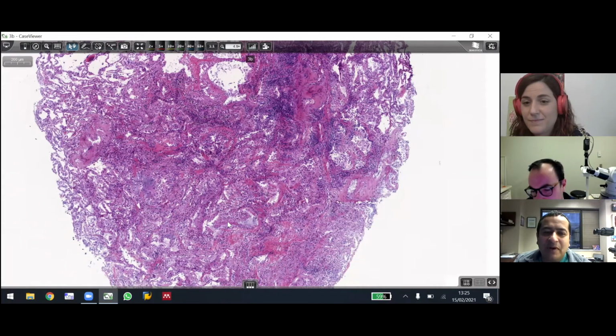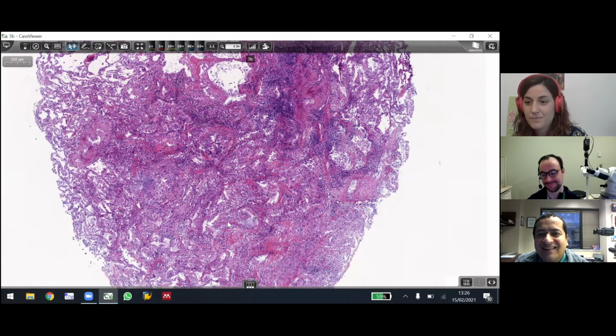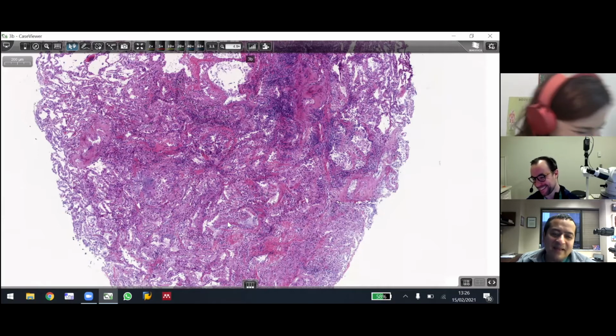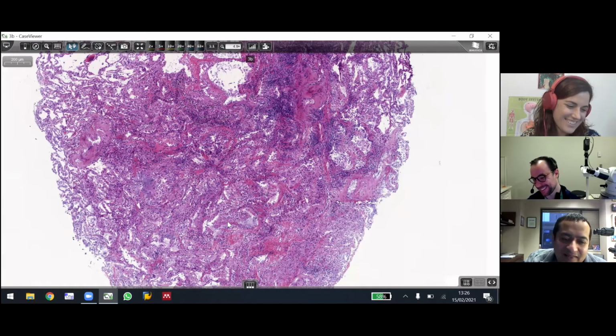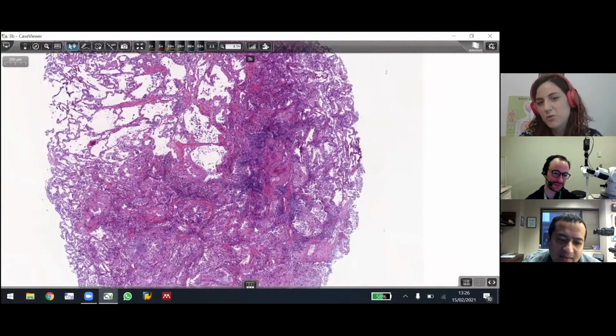I mean, let's say somebody told you this patient is a 48-year-old woman with severe rheumatoid arthritis, seropositive, right? The lung shows classic radiology for rheumatoid arthritis lung. Would you say that this is not consistent? It could be, right? Well, rheumatoid arthritis also can have OP. Yeah, exactly. I guess the main question is whether this is enough to call OP or not. Yes, I wanted to know your opinion on if this could be OP or not.